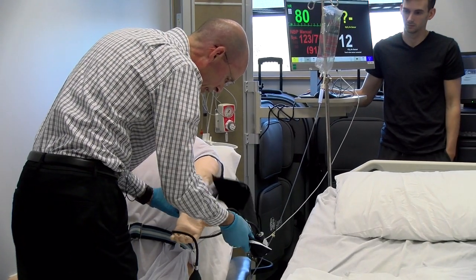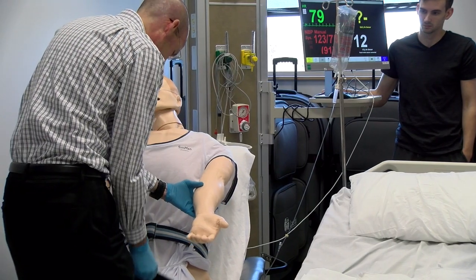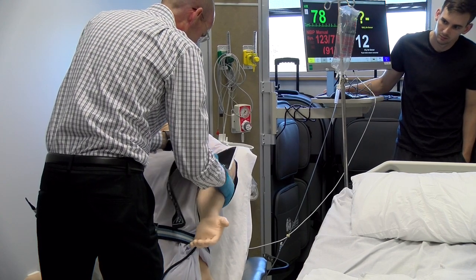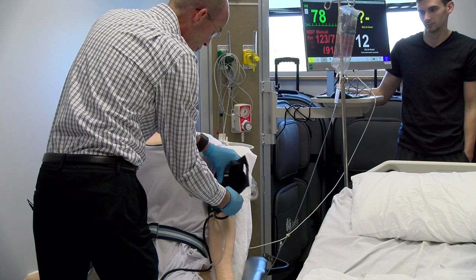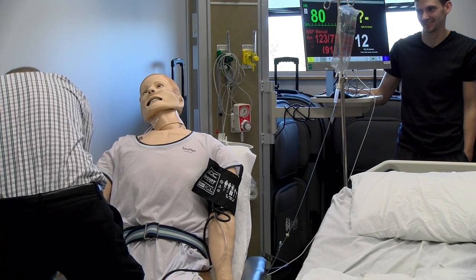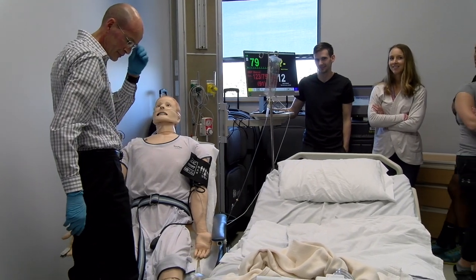His blood pressure cuff came off, so I'm going to put it back on. By the way, you can actually take — what's wrong Mr. Clark? Hold on, here we go. You ready? That's what it sounded like coming through.